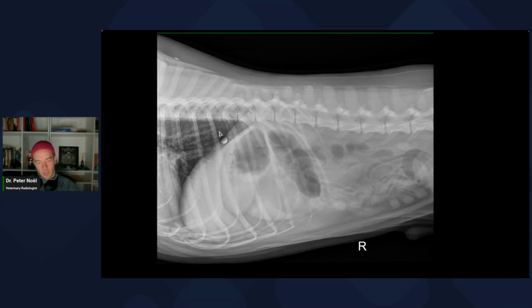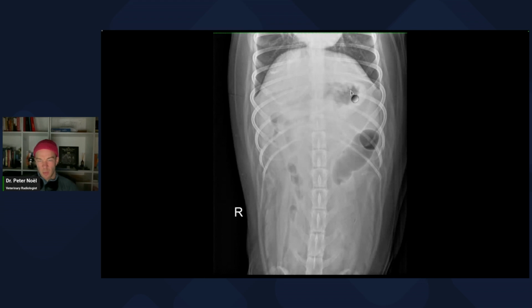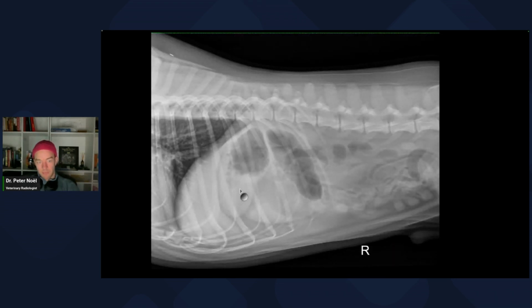So Dr. Allen's still going to ultrasound. So now you take the rad, you look at him, you go, oh boy, what's this loop right here? Okay. And then you run back out and they say that the dog hasn't vomited at all overnight. Stomach still has fluid. I don't think the stomach has very much fluid at all. I think this stomach is, look at those rugal folds, right? So it's pretty collapsed. I think actually the stomach has no fluid in it. Where is this thing? This looks like fluid, but it's just the pylorus. It's like the whole atelectasis of the stomach. There's no gas in there, and it's collapsed.